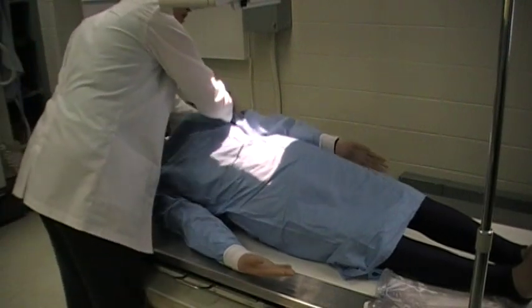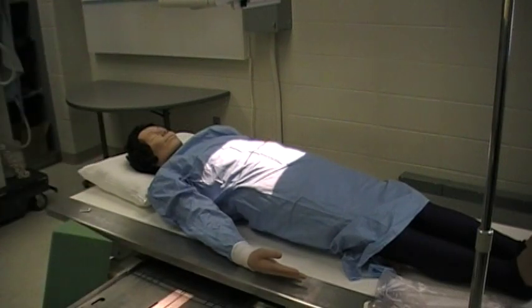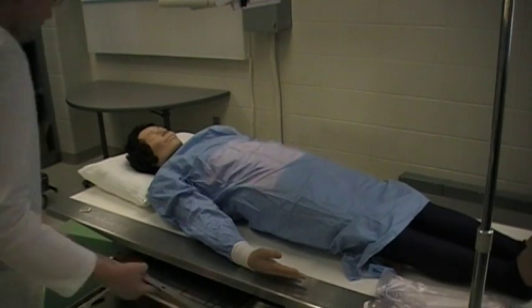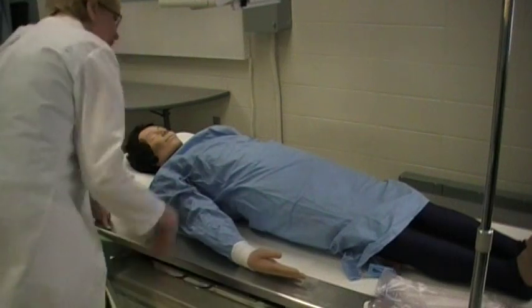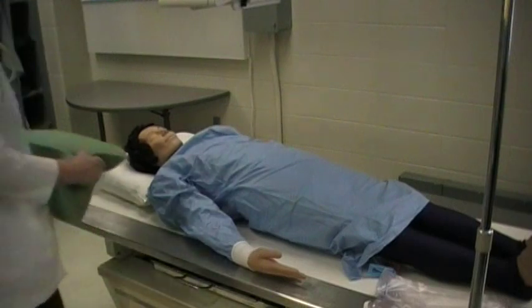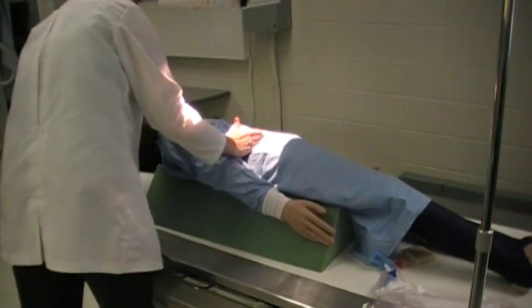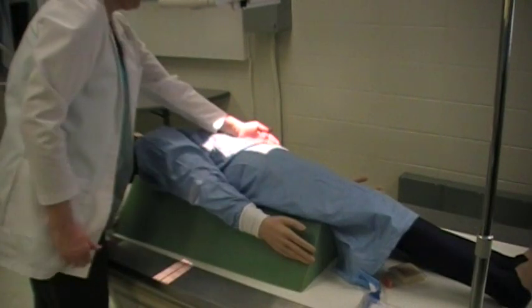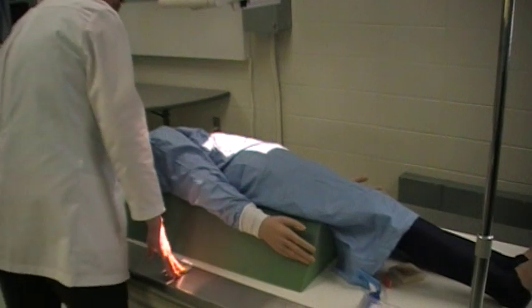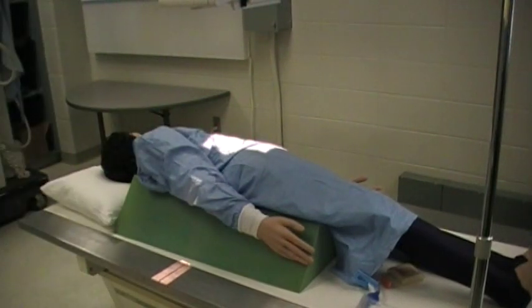Next will be the LPO. Because it's the left oblique, I'm going to use the left marker, place it to the other side of the cassette — this indicates the left side of the body. I'm going to have the patient turn 35 to 45 degrees to the left. Find the crest for your transverse line; the longitudinal line will be one to two inches on the upside laterally. So this is the LPO.